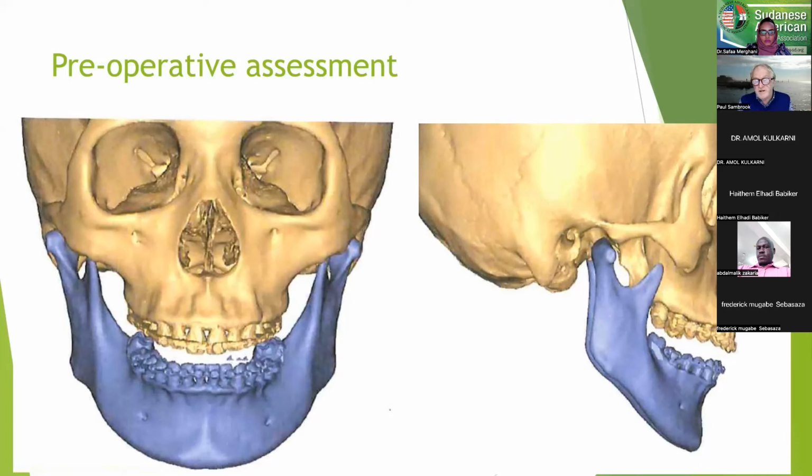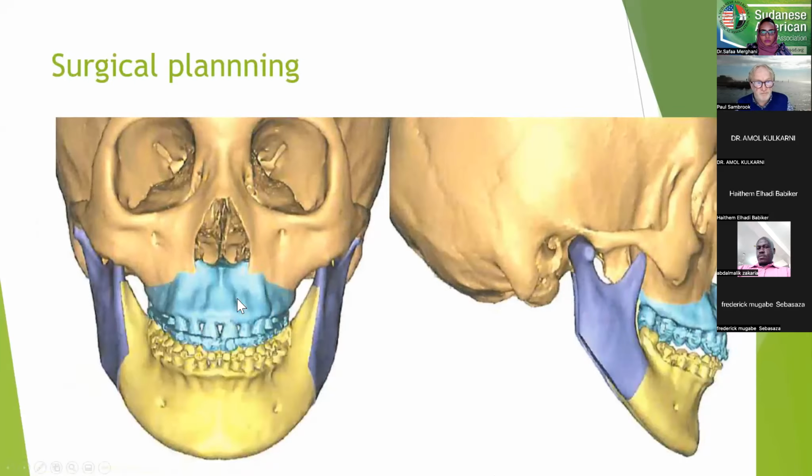And with it are a new group of problems. So we can selectively remove the mandible, the maxilla, the zygomas, in order to look specifically at the movements that those bones are making.